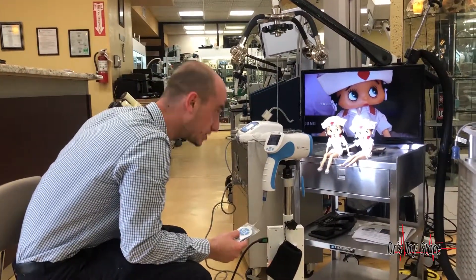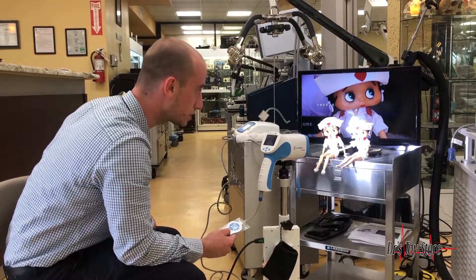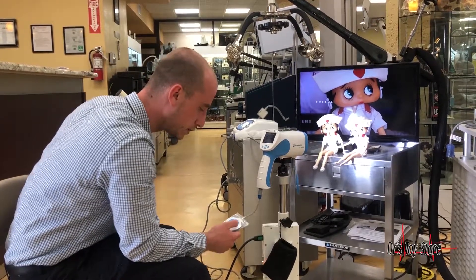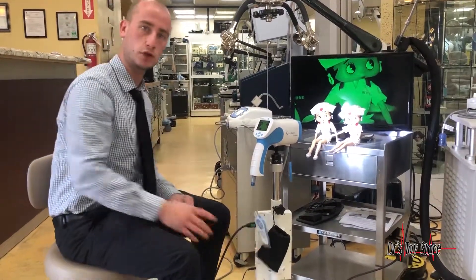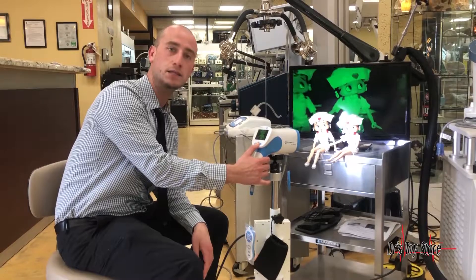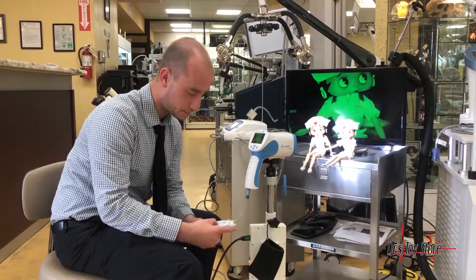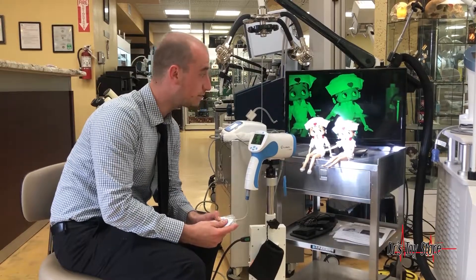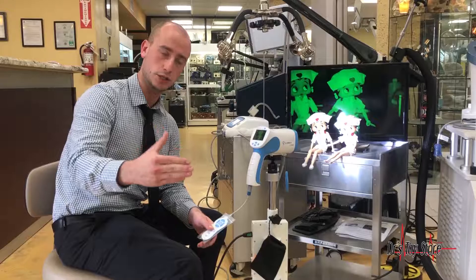On the remote you have your preset, which is the green function for what you want most of the time — like how you want to set it. Click the freeze button, click the preset, and now you have the green function so you can see the HPV virus. You also have your magnification on both — manual magnification and autofocus, and you can manually adjust the focus.